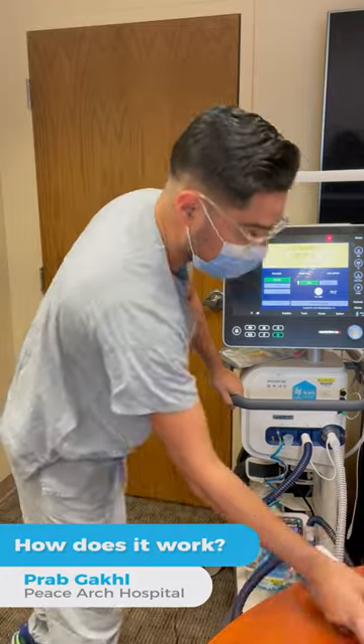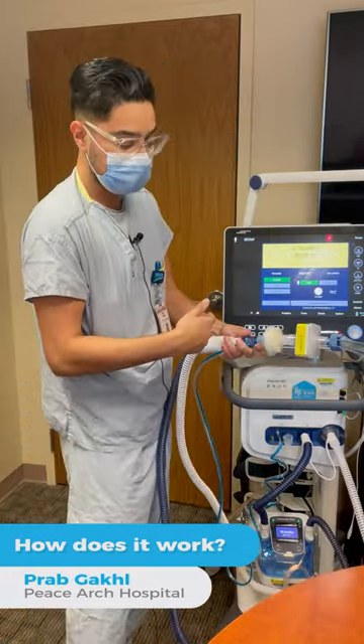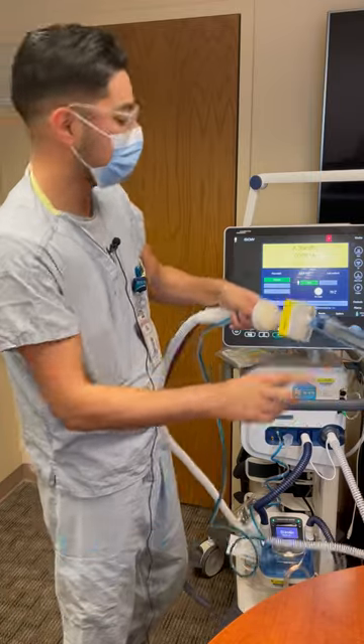This right here is just connected to a test lung. I can show you how it works. If we did have a patient that was intubated, it would connect over here to a tube that goes down into their lungs, and then this mimics the lungs here.